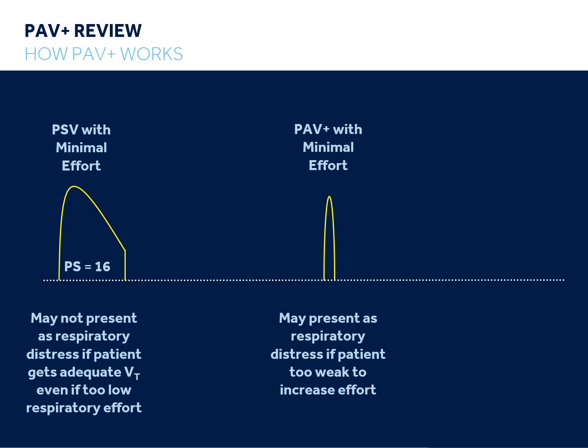This difference means that a patient making a tiny effort in pressure support may meet their ventilatory demands and continue making tiny efforts, whereas the same tiny effort in PAV may result in much smaller tidal volume, forcing the respiratory center to increase effort on the next breaths. This, along with adjustments to the percent support setting, may allow a clinician using PAV to better target a normal patient effort level with the goal of preventing further diaphragm injury.